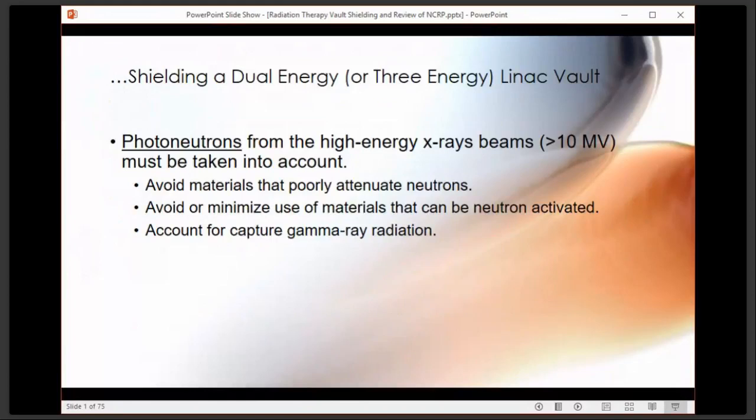The machines of yesteryear are no longer out there, but I once worked with a 45 MV Betatron, and you could walk in the room with your neutron meter and your radiation meter, just looking at the survey from X-ray photons coming out, gamma rays, and it was measurable, highly measurable.